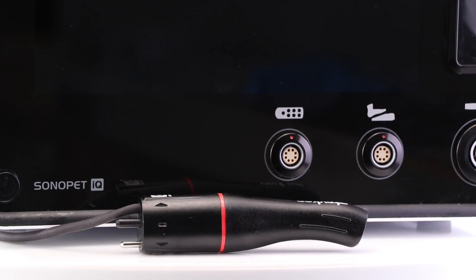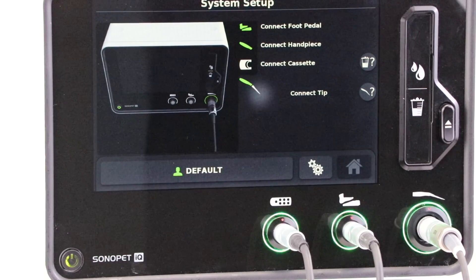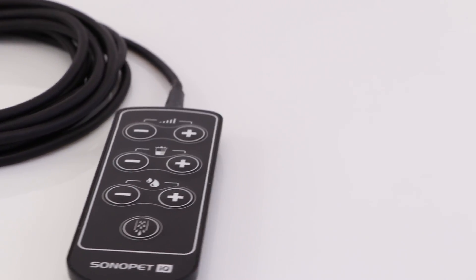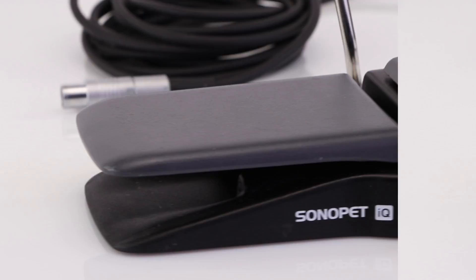Other notable features of the Sonopet IQ include a large touchscreen interface, precise settings that can be independent or synchronized for power, suction, and irrigation at lower levels, a hand controller for remote control from sterile or non-sterile fields, and three different foot pedal options to meet your needs including a basic, advanced, and advanced wireless version.